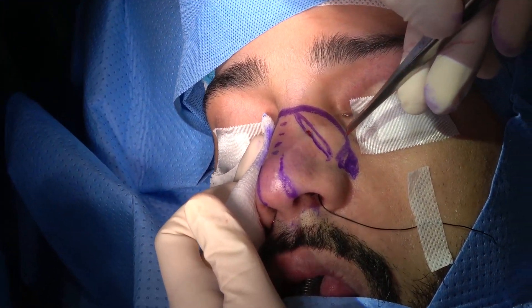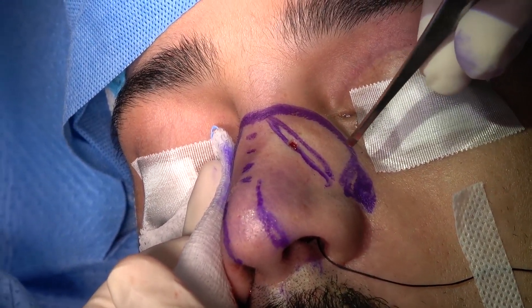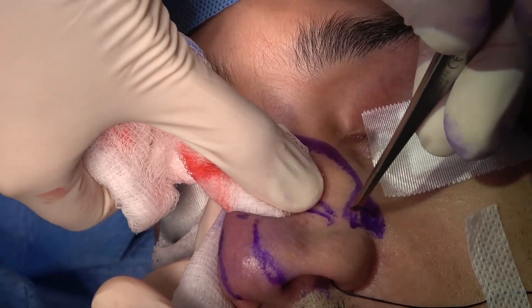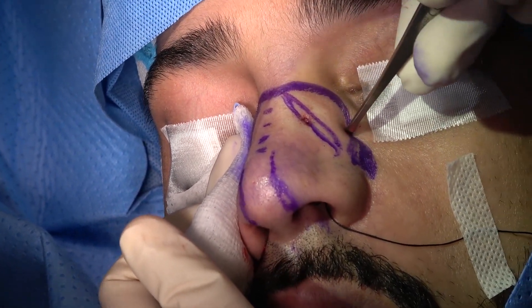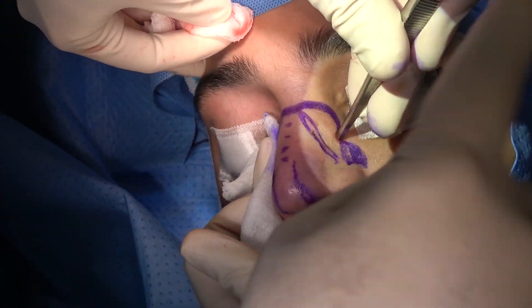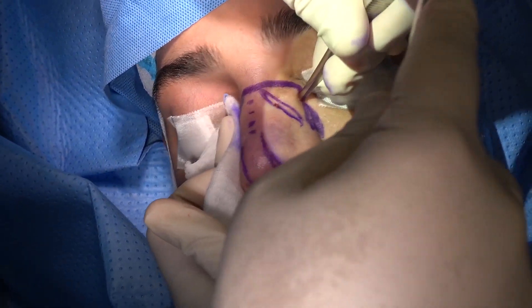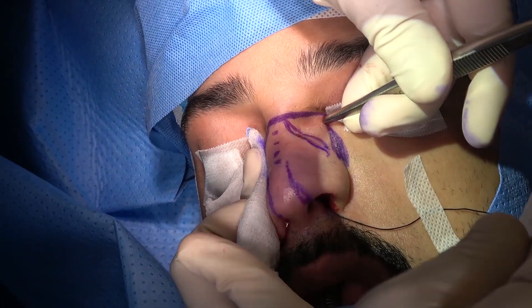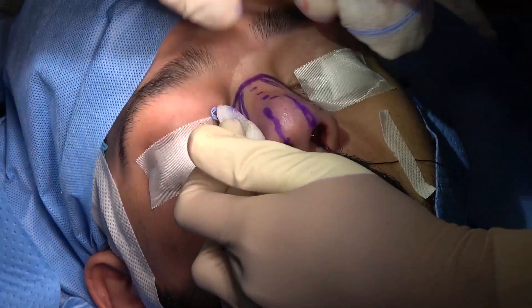Now I have transformed the direction of the osteotomy from horizontal to vertical, and I need to preserve all this bone there. So I go down, up, down, up again — and then follow my marking line all the way up to the nasal. That's it. So we have done this side now.